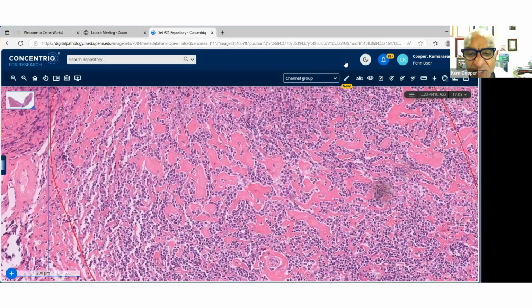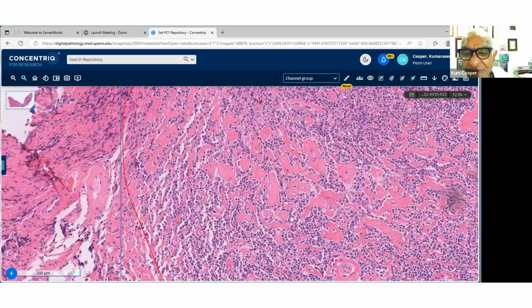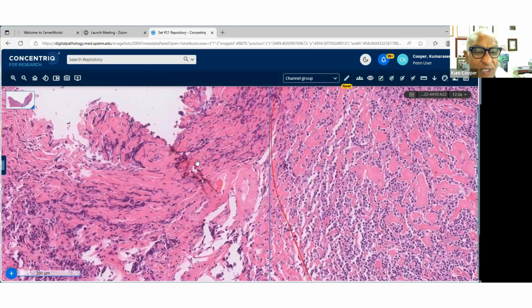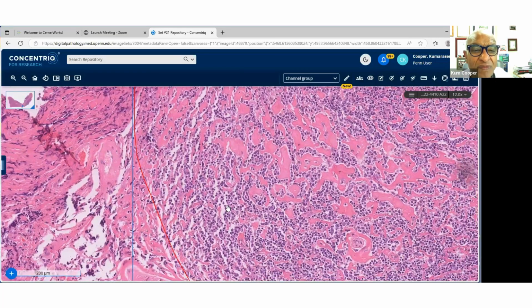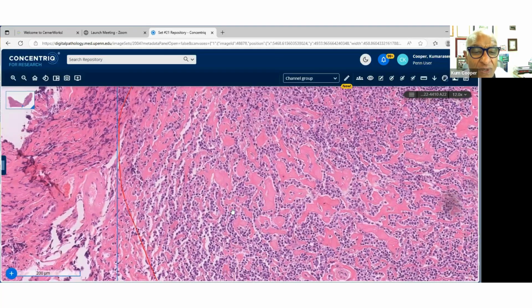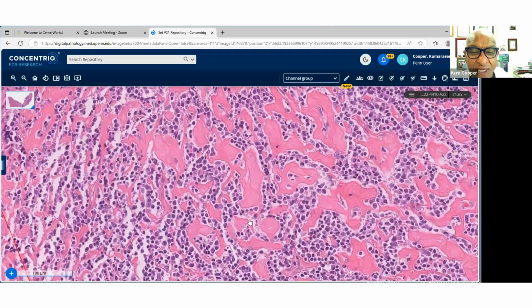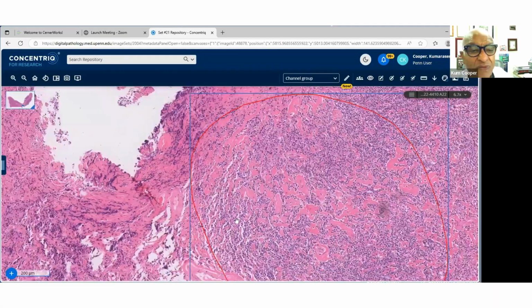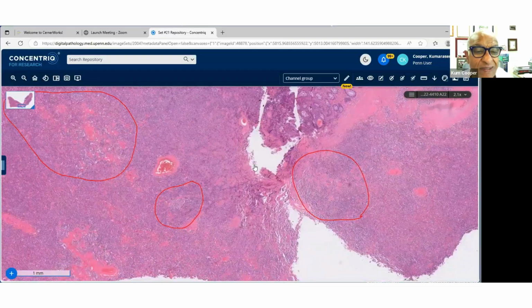Here we go. Hyalinized stroma with plasma cells. Okay, and there's one other feature I want to show you. There's another germinal center in there as well. But some of these areas here, I just want to go down on higher power, just to take you through a few more cells, just to give you a better handle on what's going on here.